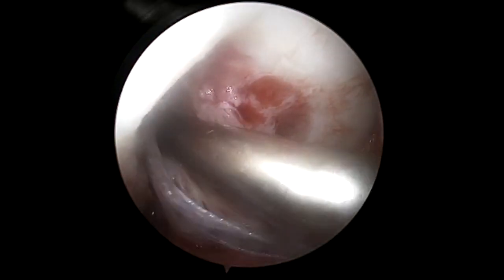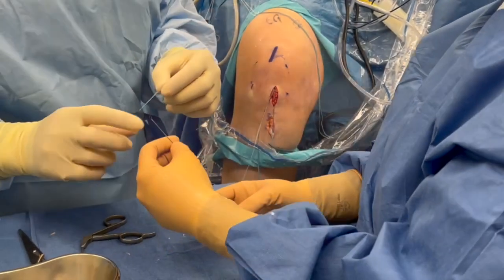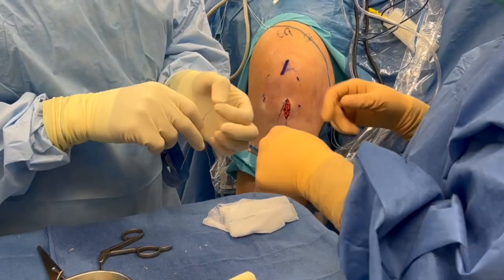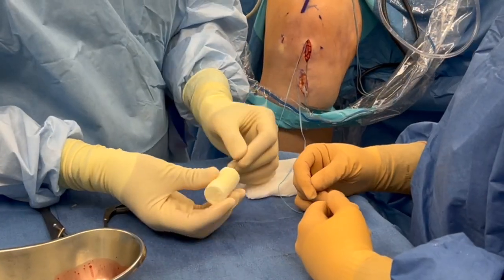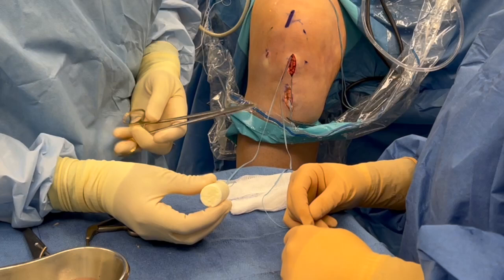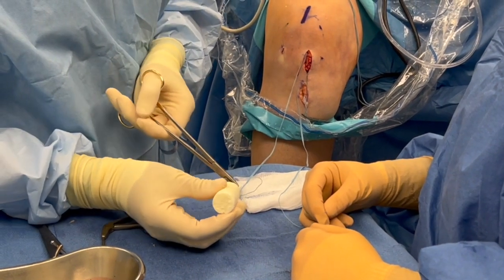We're going to pull the internal brace immediately. Here we completely dry the joint using a Frasier tip. Following this, we're going to load the BEAR implant onto the internal brace so the ACL is fully tightened. The key with the internal brace is to pass both fiber tapes through the center of the implant.